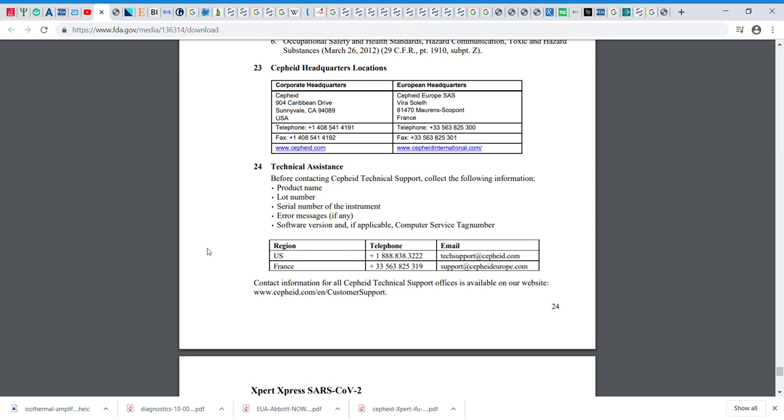And the idea is that obviously different companies make tests in different ways, and some of it could be a constraint. The Abbott test is sold as less than 15 minutes, right? Depending on whether it's positive or negative, 13 minutes, or is it 5 minutes? But they're all big established companies. And so the question is, when you say these companies in China are selling bad tests, well, what do you mean? Because there is no perfect test. The perfect test is running a PCR on your big machine in the lab, but that's just not practical, right? You can't do what we call point of care. You can't have a little machine and have non-technical people run that. It just wouldn't work.